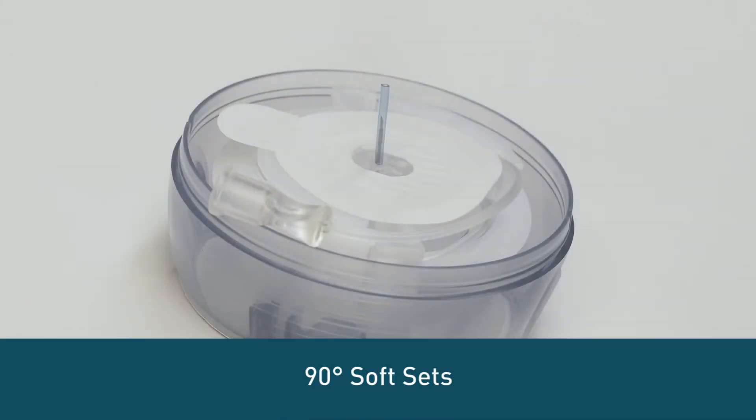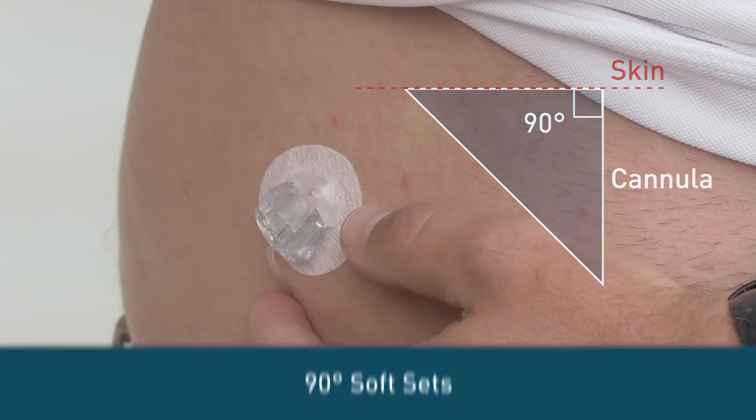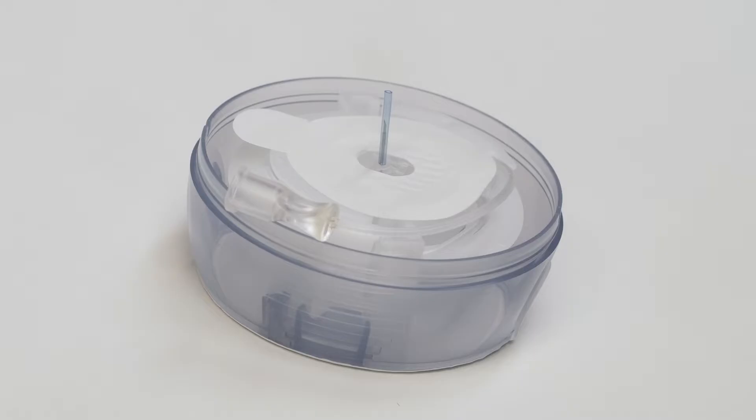90-degree soft sets are inserted at a right angle and come with either a 6 or 9 millimeter soft flexible plastic cannula. Some are manually inserted and some come with an insertion device.